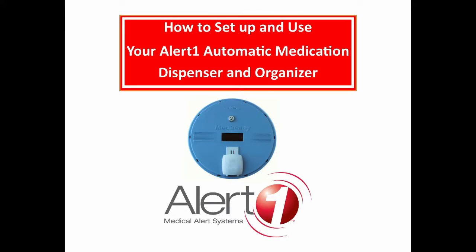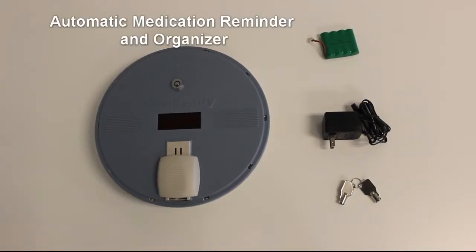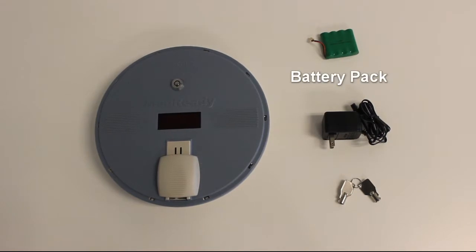How to set up and use your AlertOne automatic medication dispenser and organizer. What you're going to need: automatic medication reminder and organizer, battery pack, power cord, and keys.